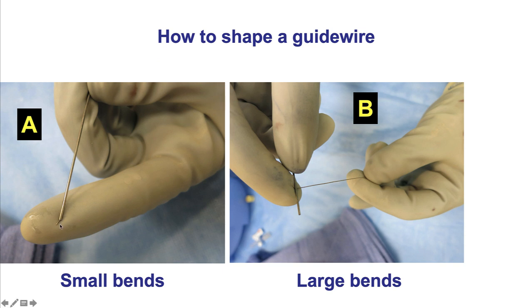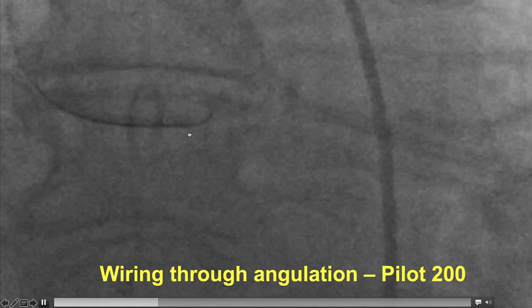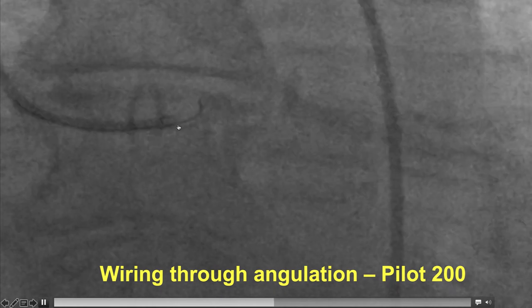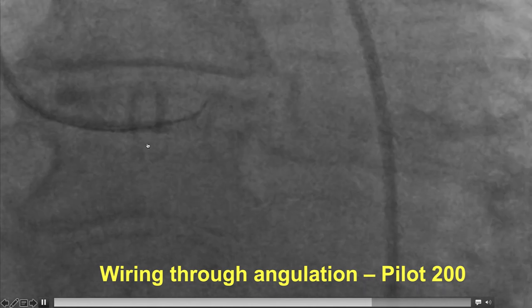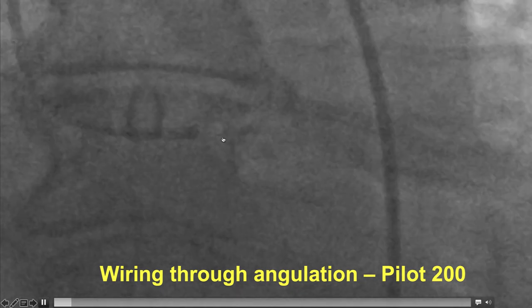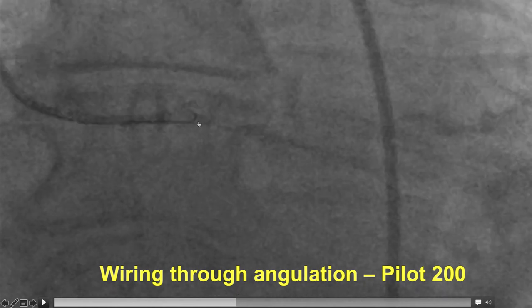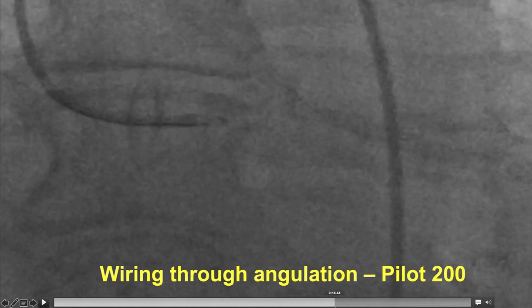Creating the right bend is important, and this can be done by using the introducer, allowing both small and large bends to be created on the guide wire. This is an example in which wiring through an angulation was challenging — the wire wanted to advance to the LAD but kept going into the circumflex. One solution was to push the guide to point it towards the LAD; the other was to use a Pilot 200 wire, which is less likely to prolapse, and eventually the wire successfully traveled into the LAD.